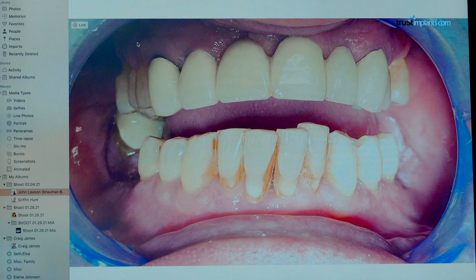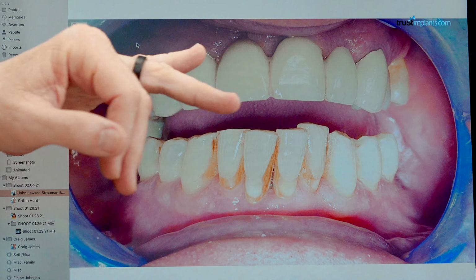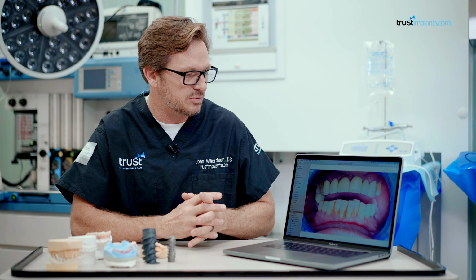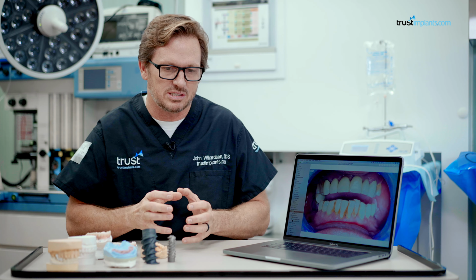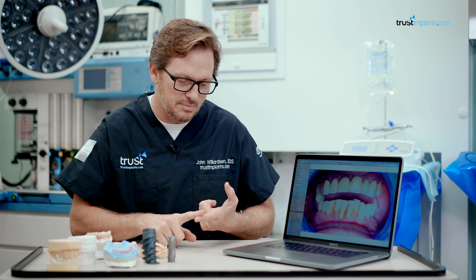This is just some before photos. We've got some periodontal disease, loose teeth, broken teeth, bridges, old crowns, broken fillings, missing teeth. So we have everything going on in this one case, which is a typical case of ours. We do see everything, because by the time the patient gets to me, they're pretty down and out. They've spent a lot of money and time in the dental chair, and now it all has to be removed.